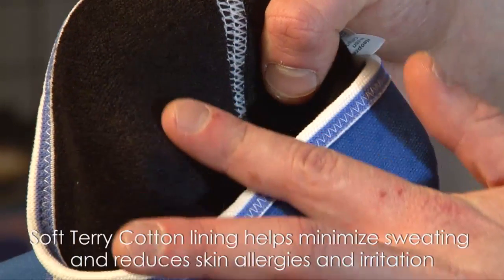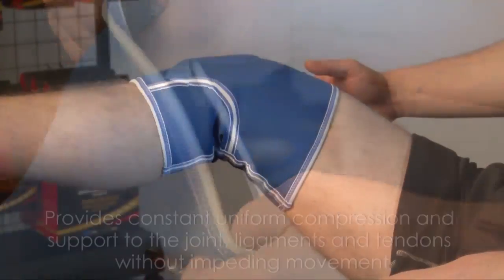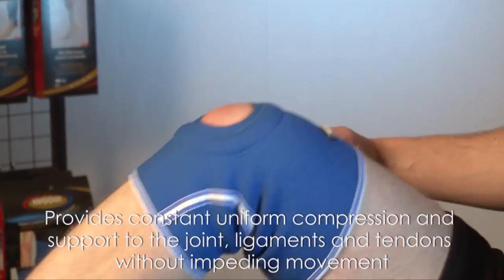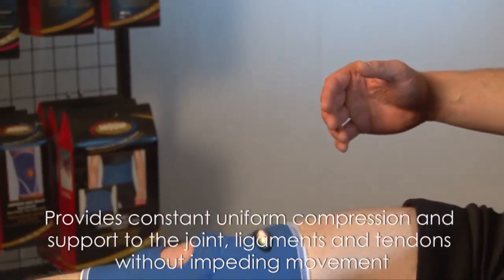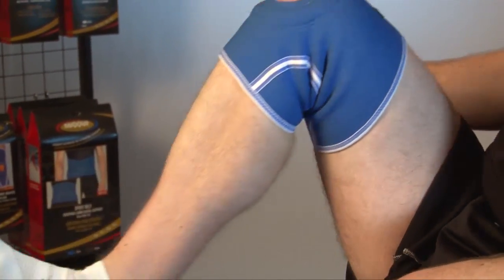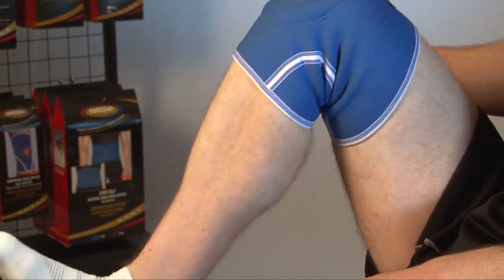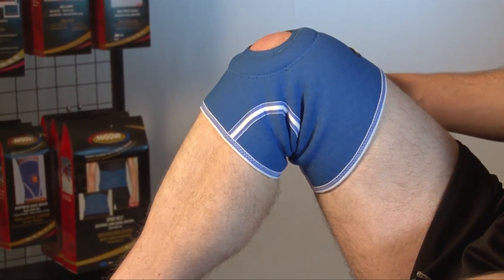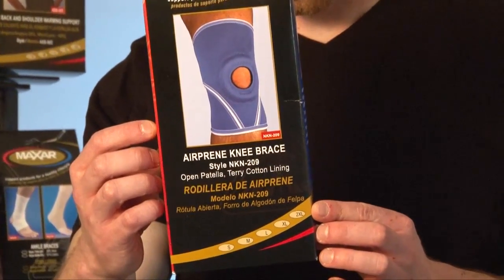Soft terry cotton lining helps minimize sweating and reduces skin allergies and irritation, provides constant uniform compression and support to the joint, ligaments and tendons without impeding movement. The Maxar AirPrene knee support is not only extremely effective but more comfortable to wear than competing products. Maxar high-quality supports represent a good investment in your comfort and health.